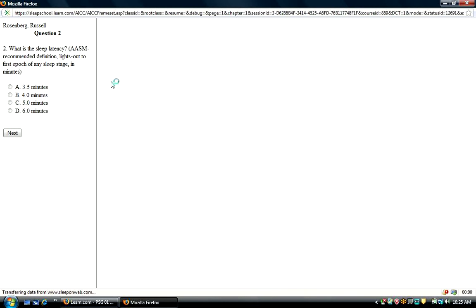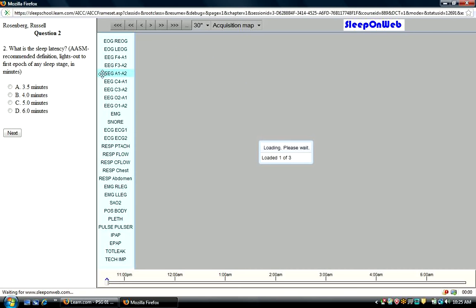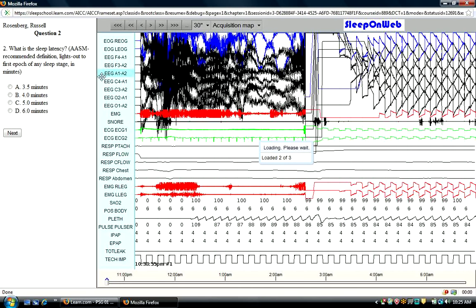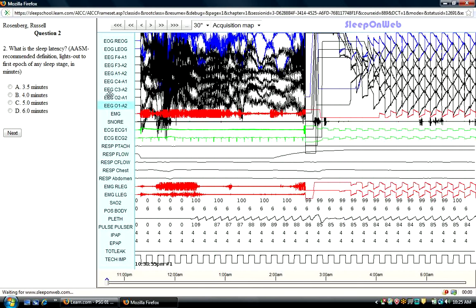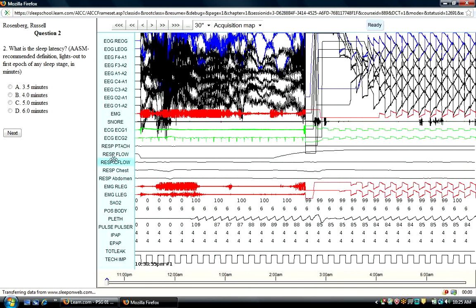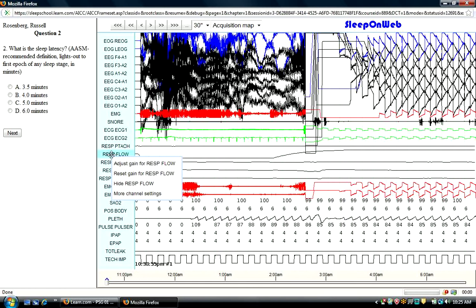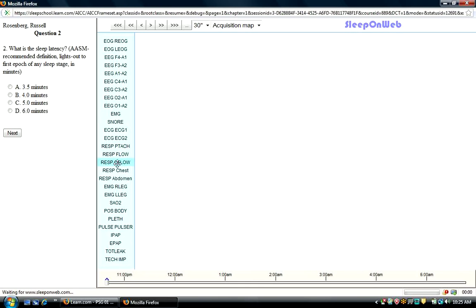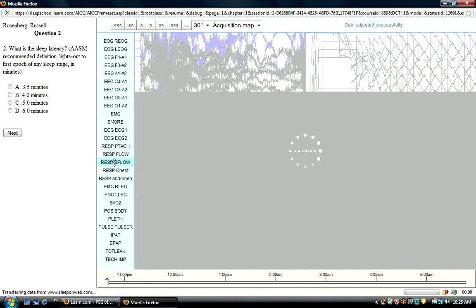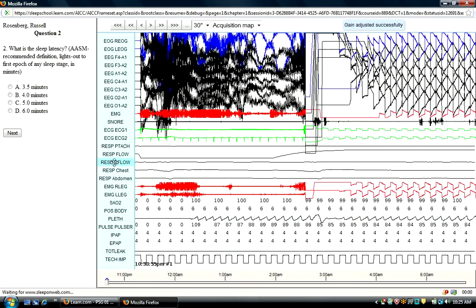One other thing I'd like to show you just very briefly as the next epic comes up and the next question comes up is that in some of these channels here, you'll find that the waveform may not be as easily seen as you might like. So you can basically right-click on it. Here, we're right-clicking on respiratory flow, and you can adjust the gain here, which will give you a little better view of that particular channel.